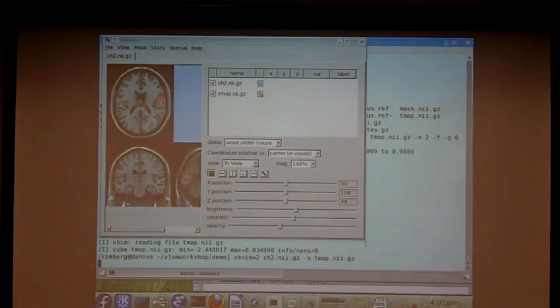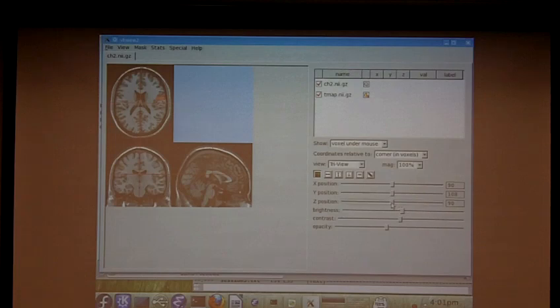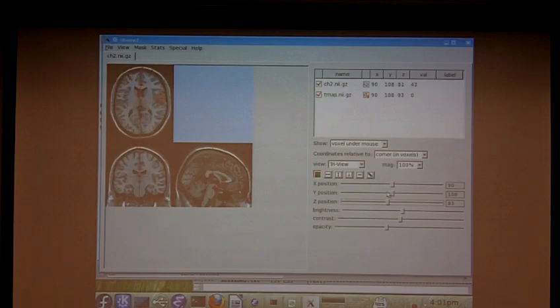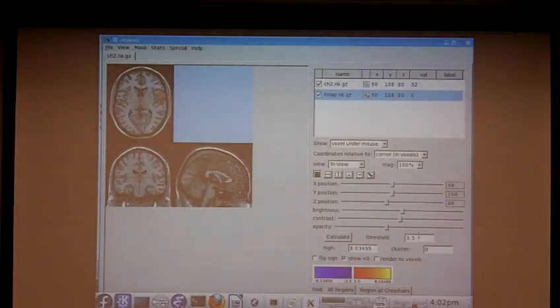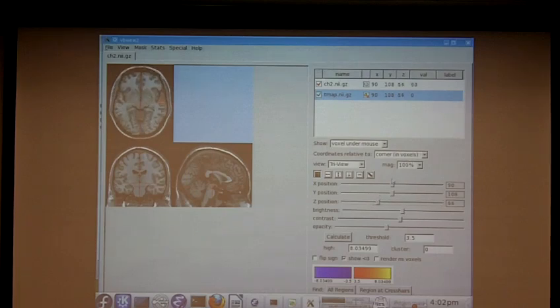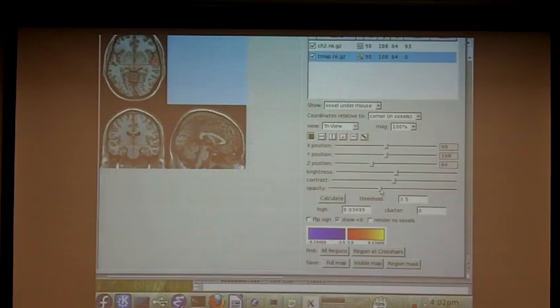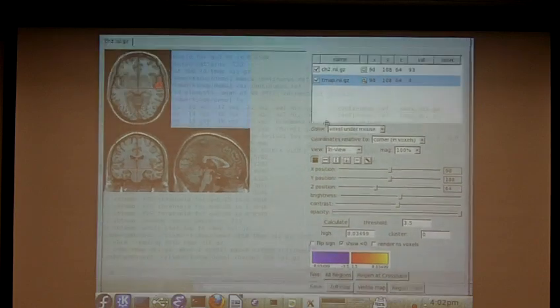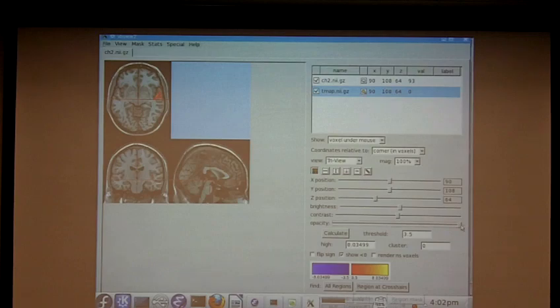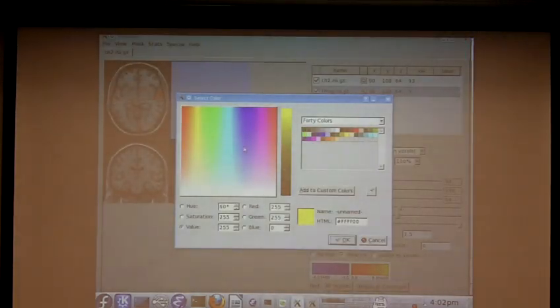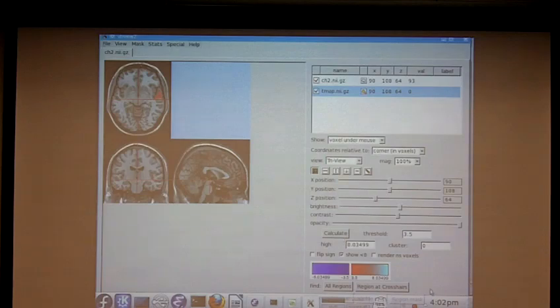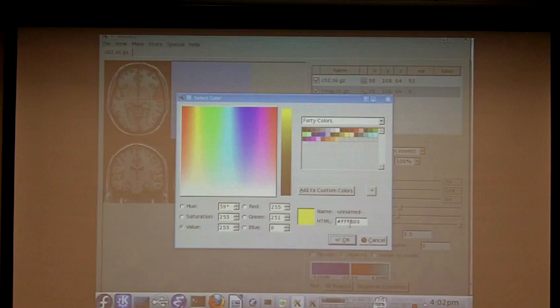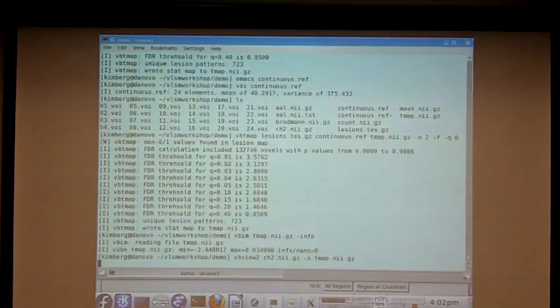I should have brought a mouse, I guess. So, I don't have much to say about this because these are artificial data and this isn't really an effect, but as you can see, there are some values that exceed this arbitrary threshold of 3.5 and some that don't. So, I guess that's not shocking because we already checked and saw that there's some values as high as 8. You can, if need be, adjust the opacity of the stat map so I just made it a little easier to see in bright light. But these are just display things. You can also double-click on this and adjust the color scale if you want. I don't necessarily recommend it in every case, but some people have strong feelings about what color scale is right for their work.